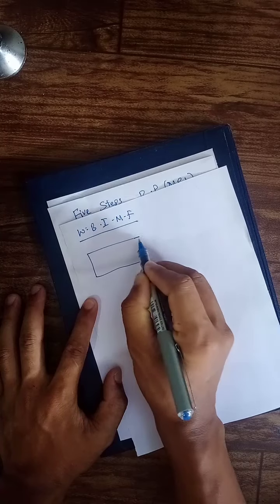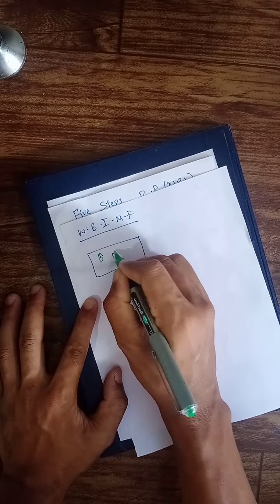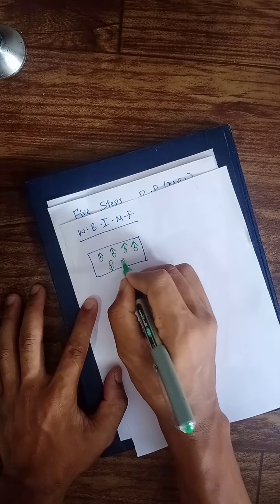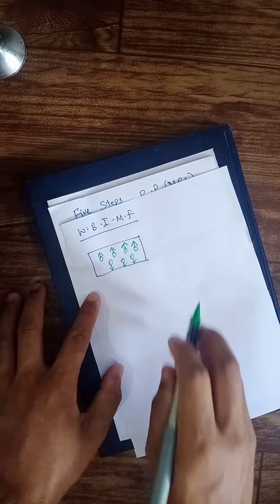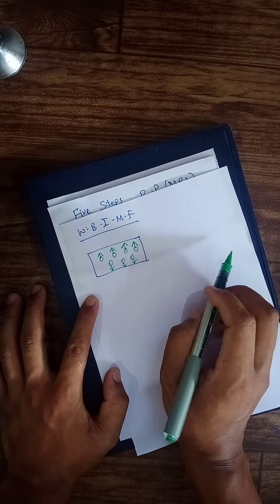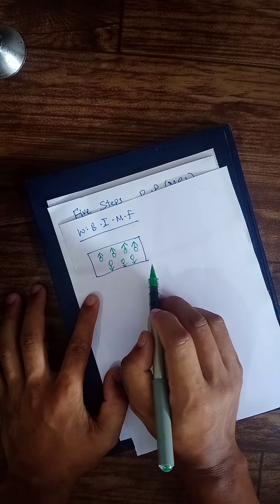See here, this is your body. Now see the protons. Can you see now the arrangement? It is directed parallel or anti-parallel. But can you see the lower number is directing towards the anti-parallel direction?